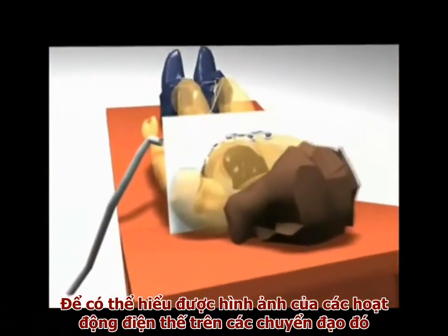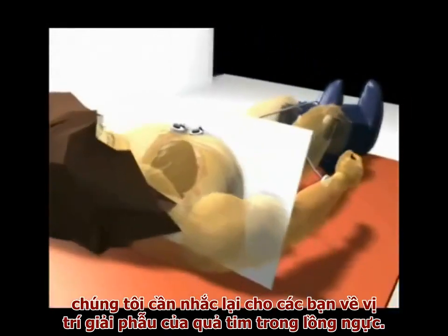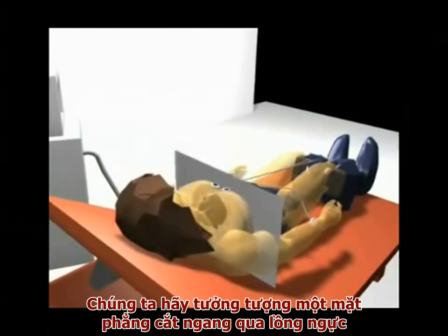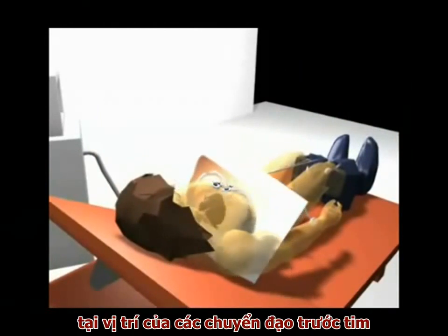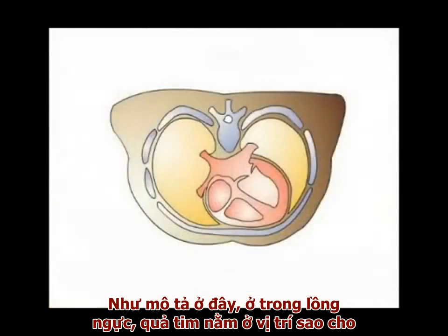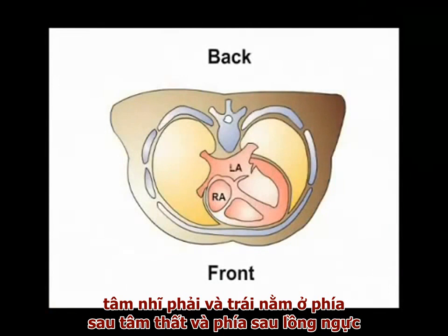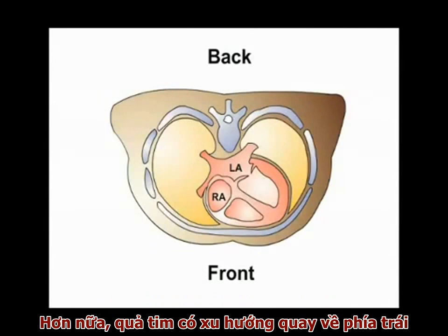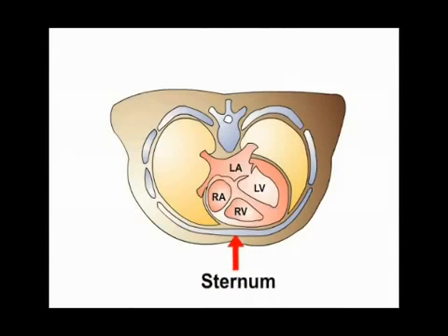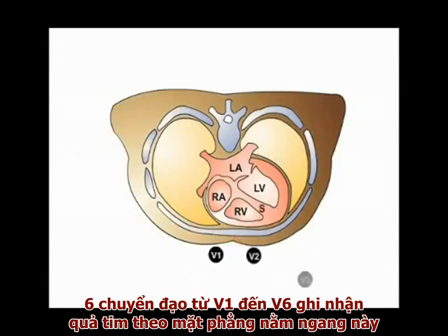In order to understand their view of cardiac electrical activity, we need to remind you of the position of the heart in the chest cavity. Let's examine a horizontal section of the chest taken at the level of the chest leads. As illustrated in this section through the thorax, the heart is positioned such that the right and left atria sit behind the ventricles at the back of the chest. Furthermore, the organ is rotated towards the left, so that the right ventricle lies anterior to the left, immediately behind the sternum. The 6 chest leads, V1 to V6, examine the heart in this horizontal plane.